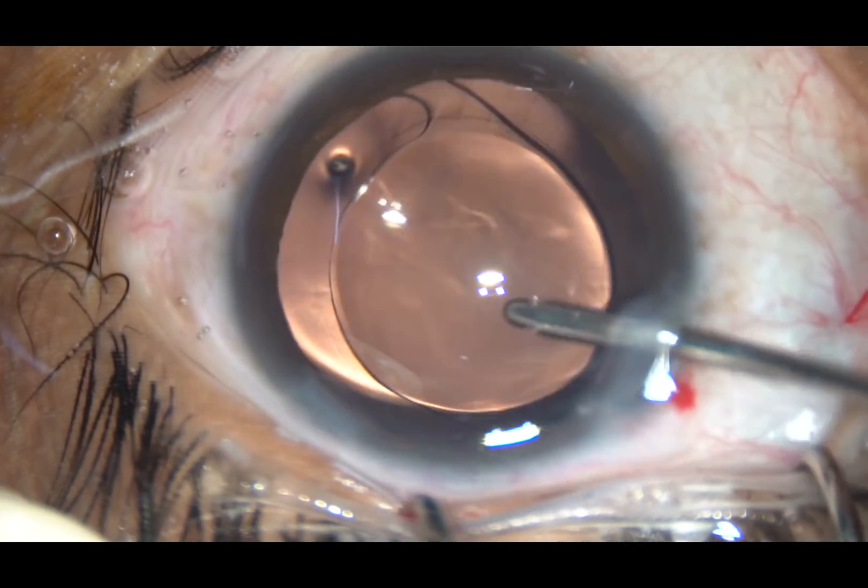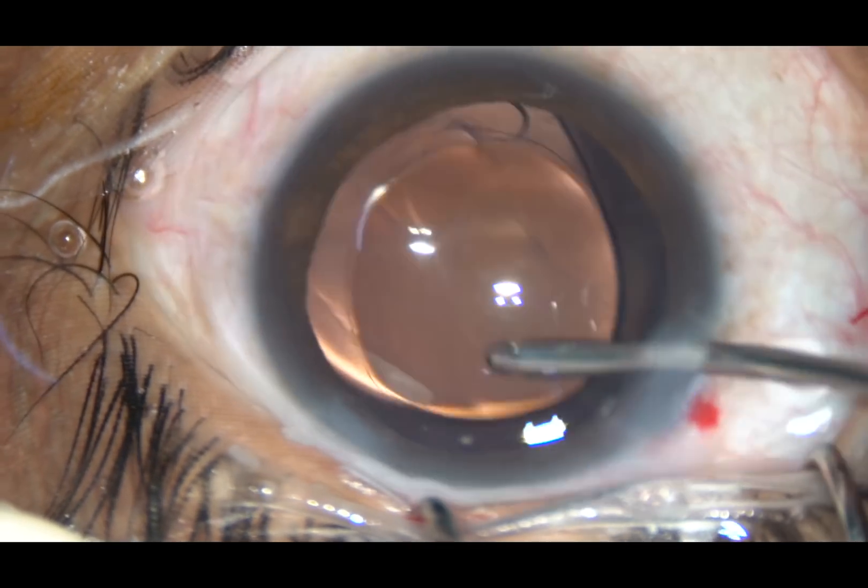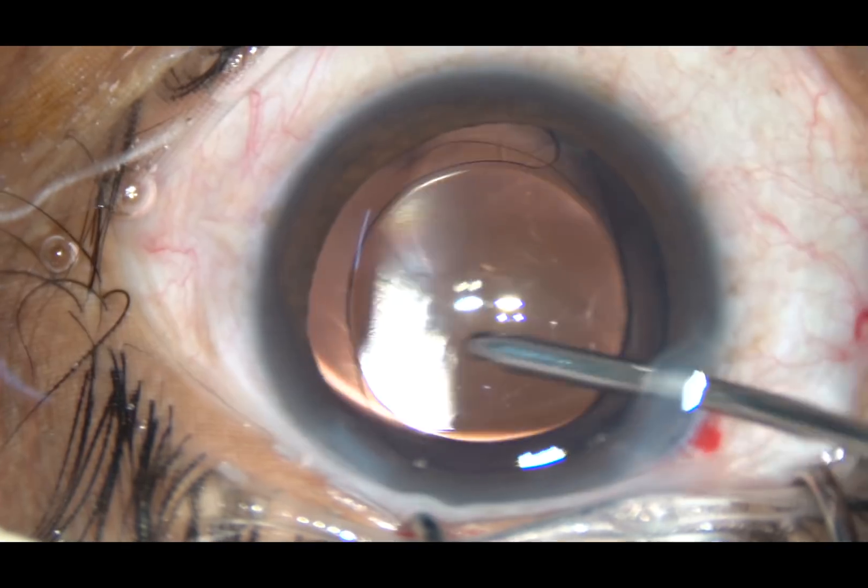The irrigating probe is used to dial the lens, and whatever viscoelastic substance was there in the lumen of the cartridge is irrigated out.